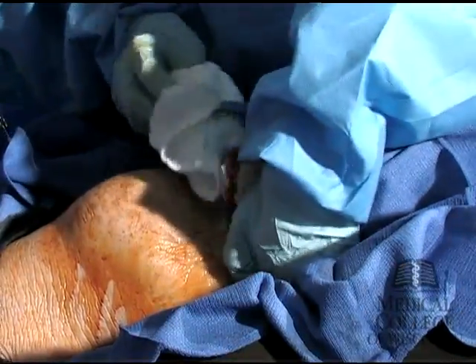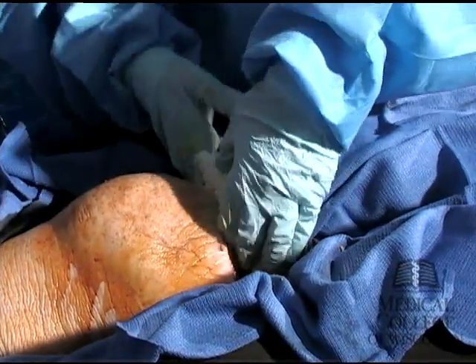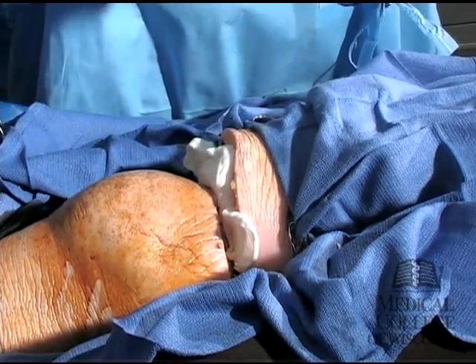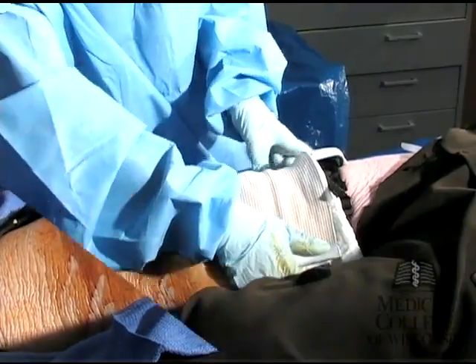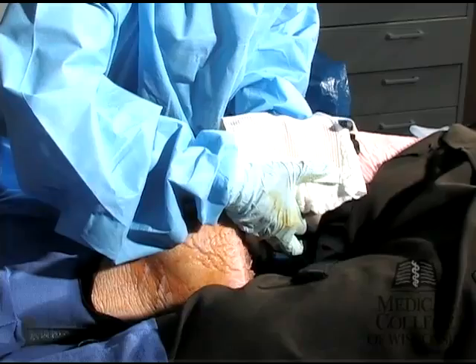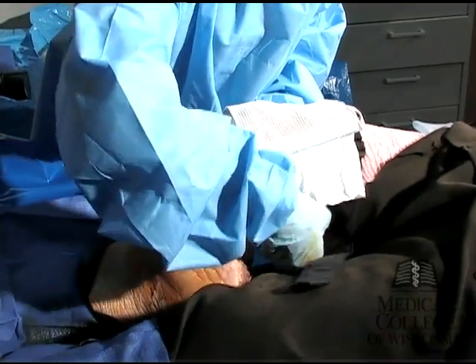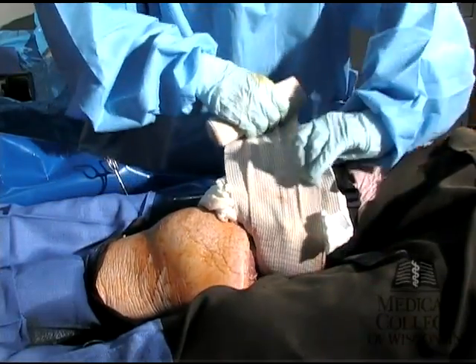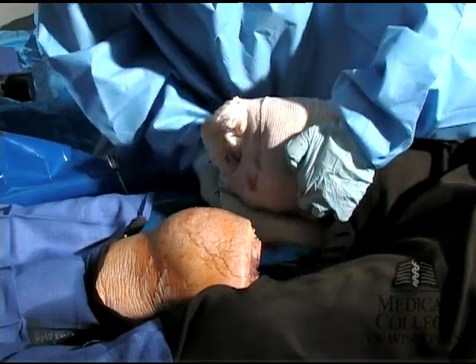Once hemostasis is achieved, generous, sterile, soaked gauze pads are placed over the amputated limb and secured in place with an ACE wrap. If possible, retrieve the amputated limb and dress with sterile saline soaked gauze and place within a clean bag and transport with the patient.